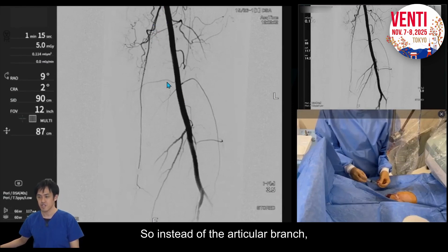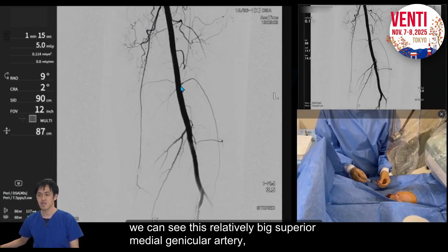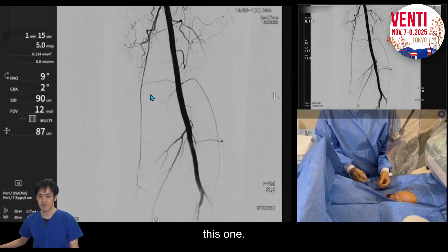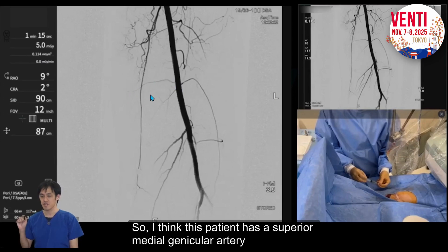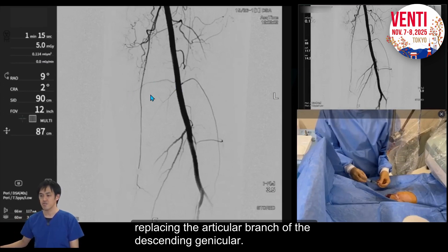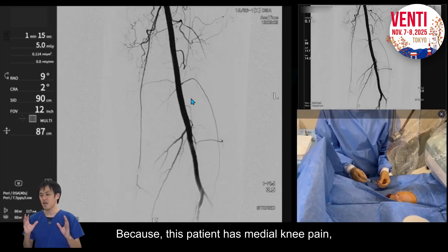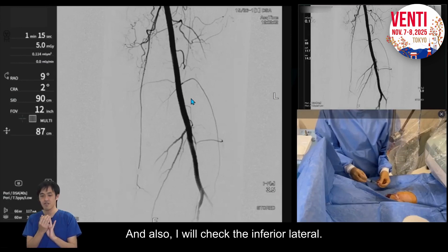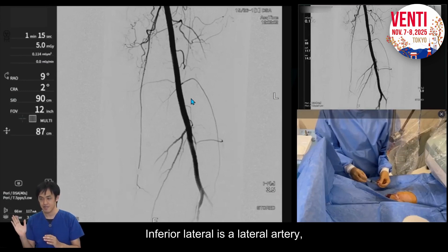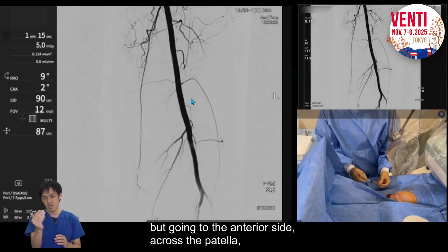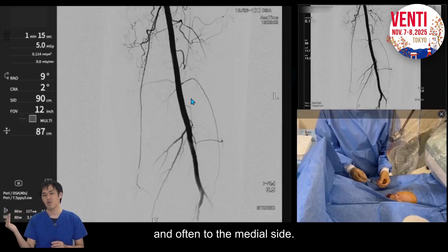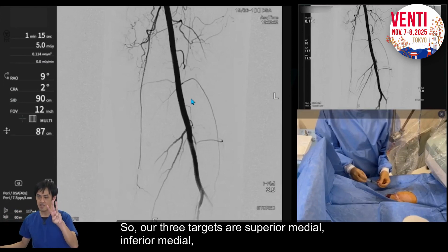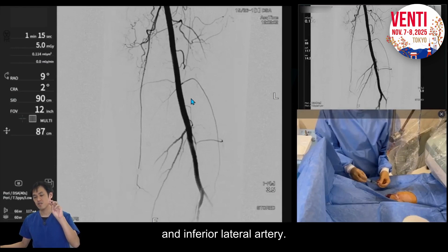Instead of the articular branch, we can see a relatively large superior medial genicular artery, which I think has replaced the articular branch of the descending genicular. Because this patient has medial knee pain, we have to check the superior medial and inferior medial. I will also check the inferior lateral, which is a lateral artery but goes to the anterior side and often crosses to the medial side. Our three targets are superior medial, inferior medial, and inferior lateral artery.